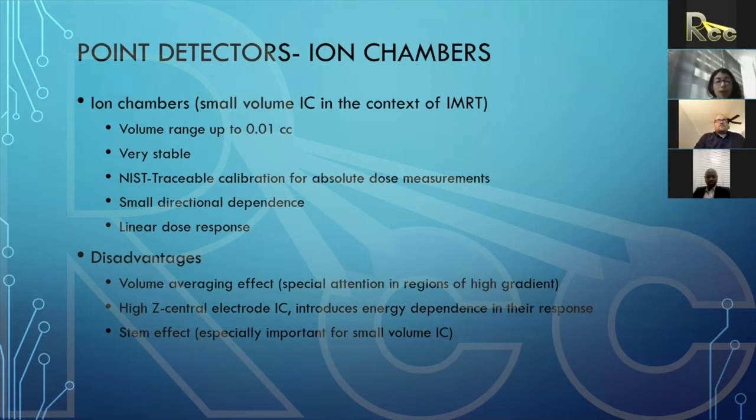Depending on the design of your ion chambers, there are some that use a high Z central electrode, and this introduces energy dependence in the response, because what these types of ion chambers are doing is over-responding to low energy photons.